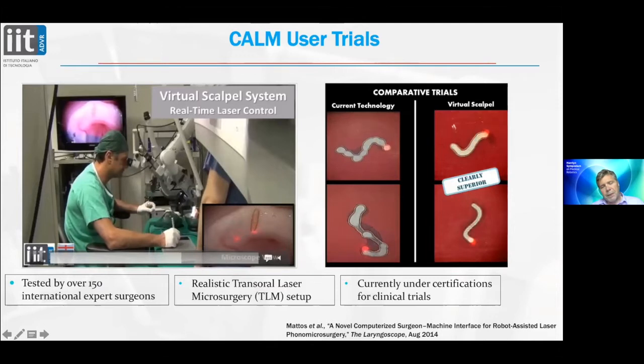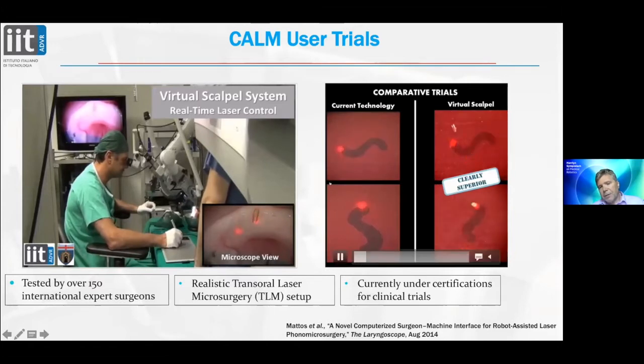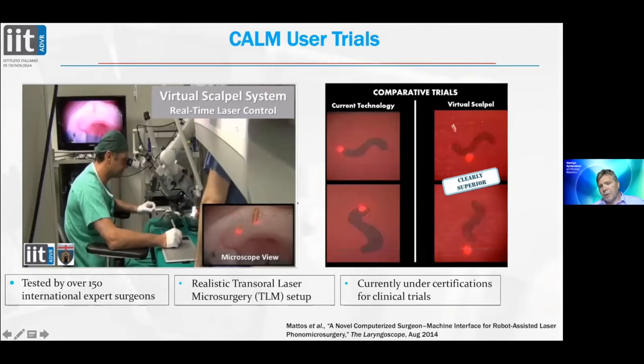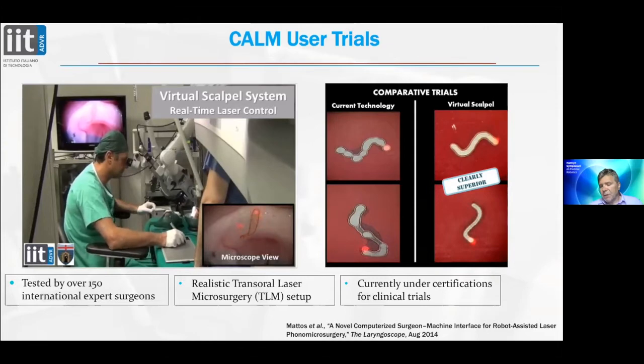The surgeon actually is manipulating with his left hand. Down here, we can visualize what he actually sees through the microscope, and up here is a larger display. And on the right-hand side, we can actually see the types of tracking you actually get. So this is an example just onto plaster blocks. And on the left-hand side, the two left-hand models, what you actually see is this is a state-of-the-art system, so using the conventional joystick to do it. And you can see there is tracking. The idea is that the surgeon is actually supposed to stay in the S-shaped line. And you can see that they approximately do that. But there's a certain spotting and there's movement outside the line. If you actually go to the right-hand images, what you actually see is very, very high precision tracking. You see it's very, very accurate. So you see that the actual CAM system is able to give that very high precision.